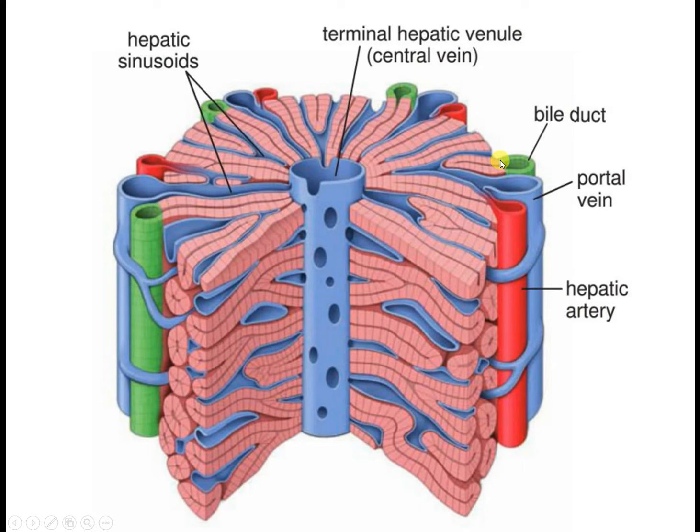And the cells present between them, which are non-differentiated, are like stem cells for both hepatocytes and cholangiocytes. The point is, these cells are mitotically active. They can produce other cells, can produce hepatocytes, but these cells can't produce hepatocytes, they can't divide anymore, and you see this direction.